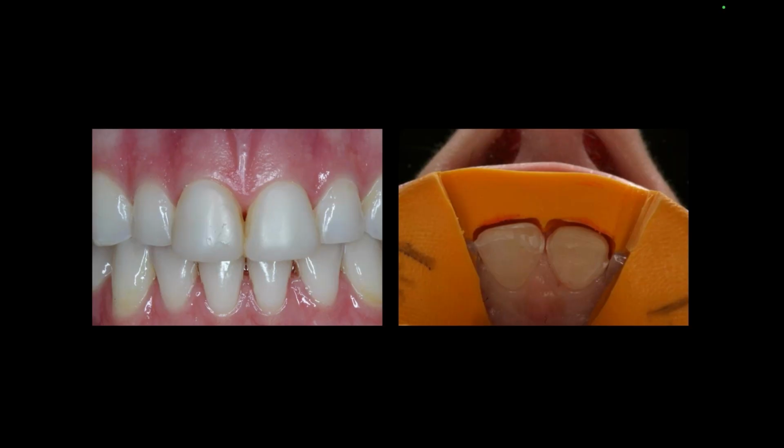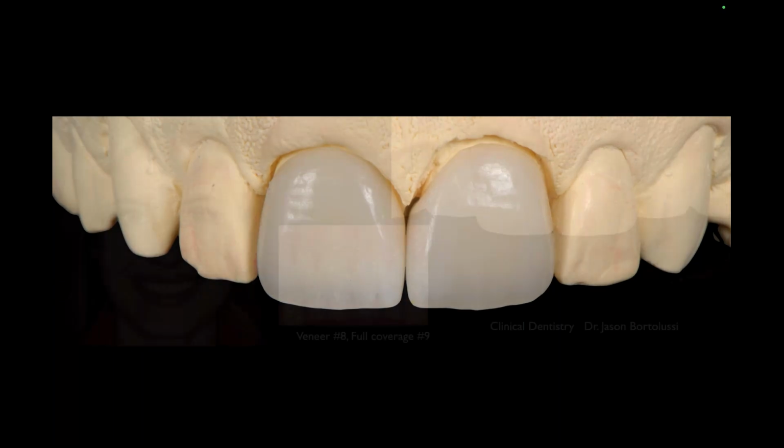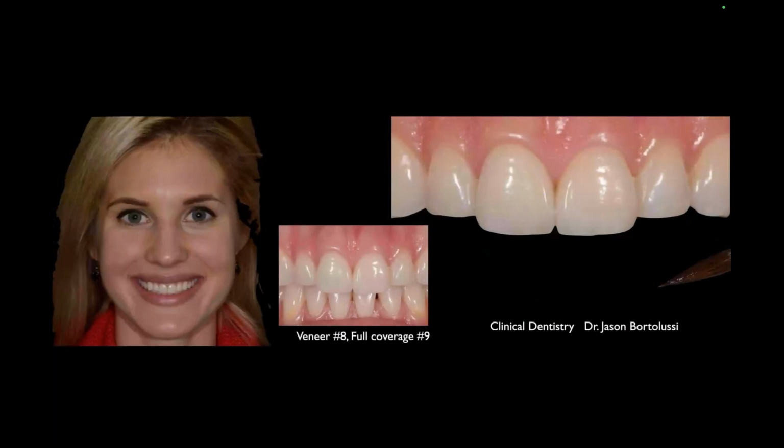And that gives me the ability to have a little bit of opacity in the core at 3/4 of a millimeter, and then do my layering outside. So again, thinking through your materials is really the key selection to balancing that. And you can see here the difference when I have basically 2/3 of a millimeter or almost a millimeter of space, how I'm trying to balance those two out. And we put them in the mouth. I think they blend pretty well.